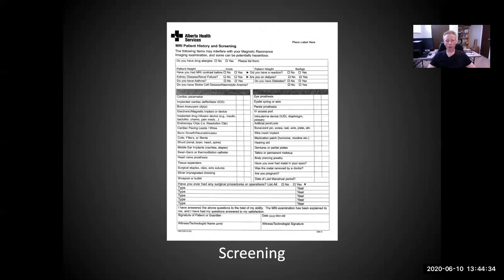And so I'm going to go over this briefly, in the sense that I'm not going to be explaining every medical term that's on here in detail, because for a level 1, you certainly don't need to know that. What you do need to know is enough such that you can pre-screen a participant, and if you're uncertain about something, then seek advice from someone that knows before you book a person in for a research scan. Okay, so let's look at the major sections here of this form.